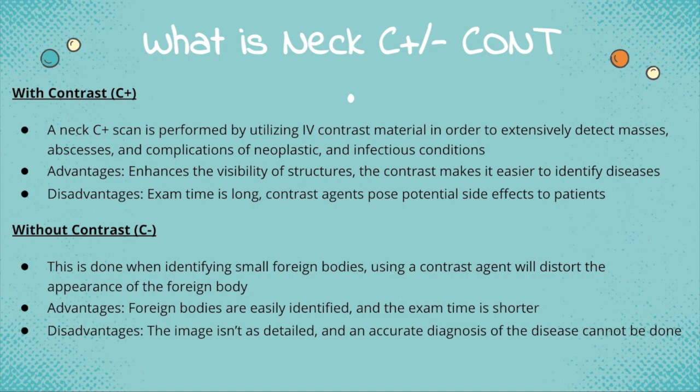For this type of exam, a non-ionic contrast is administered through an IV bore which is present in the antecubital fossa. In the duration of 48 hours, there should only be one CT contrast study scheduled. Within 72 hours of the CT scan, BUN and creatinine should be performed. The night before the scan, only clear liquid should be consumed after midnight and nothing else. 4 hours before the exam, no food or drink is to be consumed.